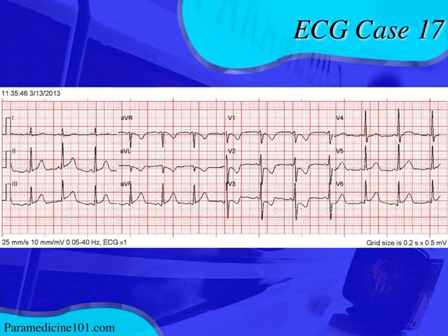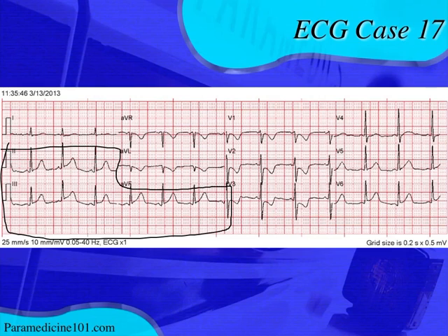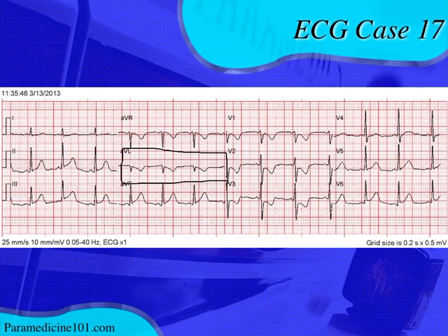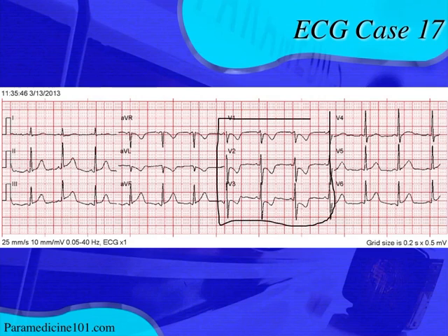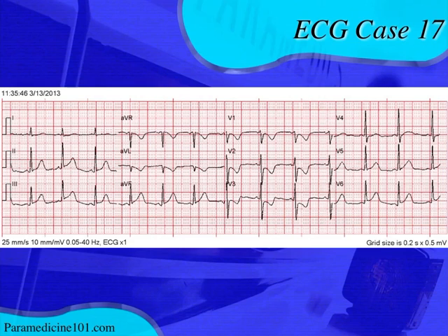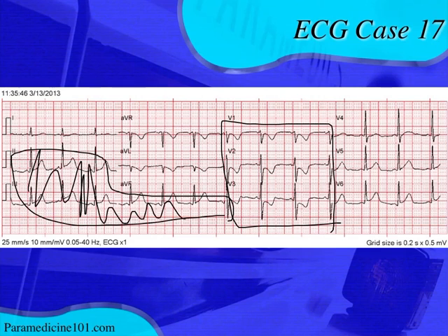Looking at ST and T-wave changes, it is difficult in the inferior leads to identify if there's any ST elevation because we have a wavy, wandering baseline. However, this morphology in AVL — with T-wave inversion and ST depression — the first thing you have to think is early inferior wall MI. This pattern in AVL usually means early inferior wall MI; there's not much else that will cause that morphology. We're considering an early inferior wall MI, but we can't confirm it because of the wavy baseline in the inferior leads.